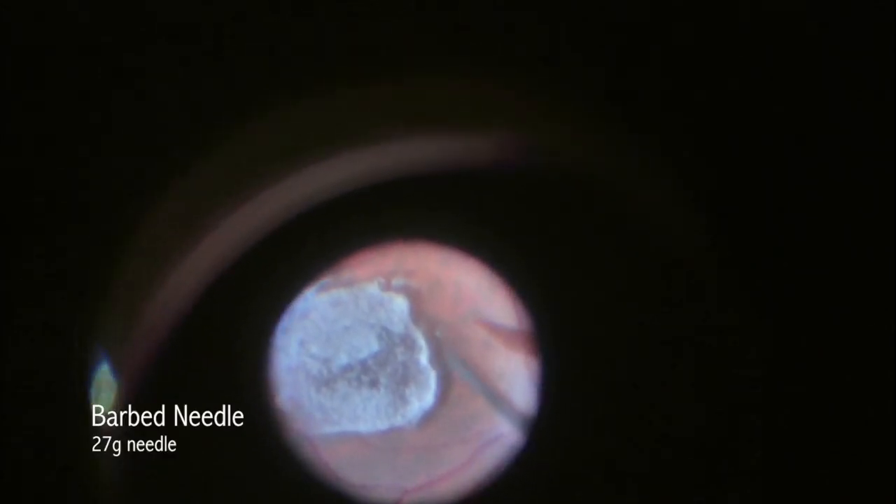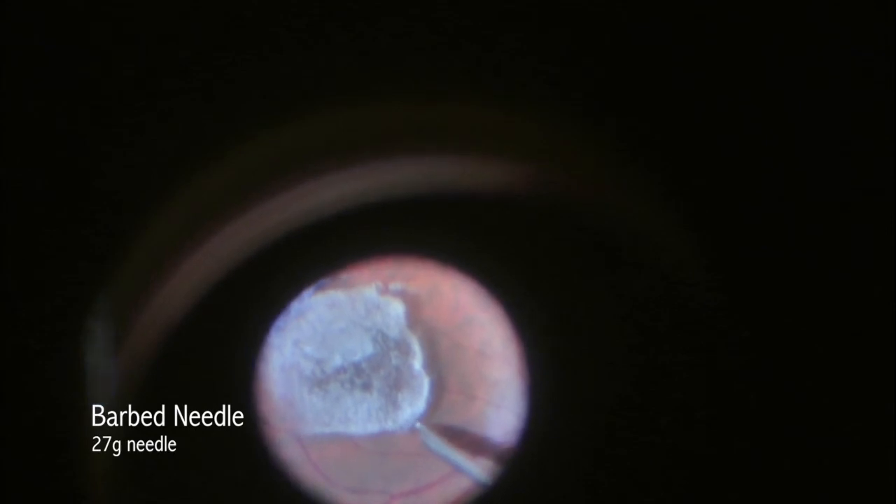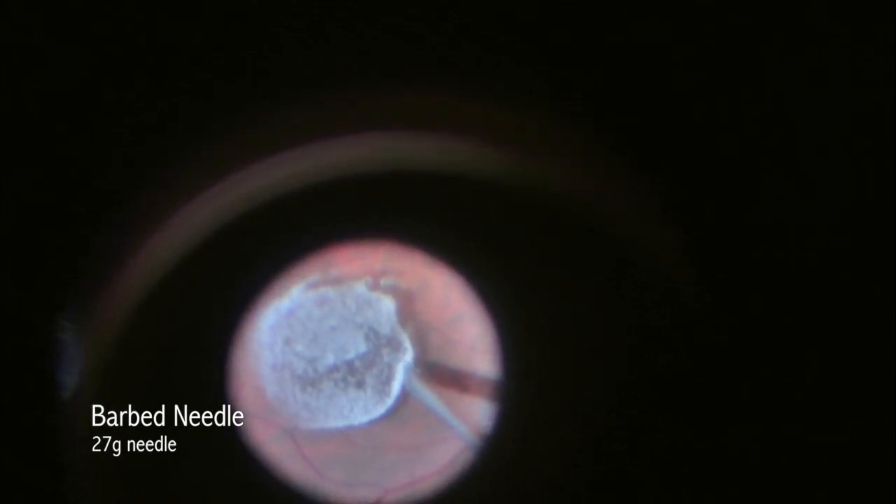Finally, I utilized a bent 27-gauge barbed needle. It is this barbed 27-gauge needle that is able to catch the opening of the posterior hyaloid and help elevate it, so that we now have an opening and can proceed with our vitrectomy.